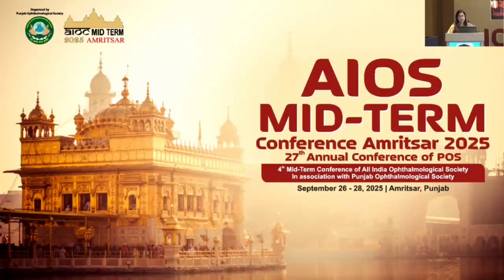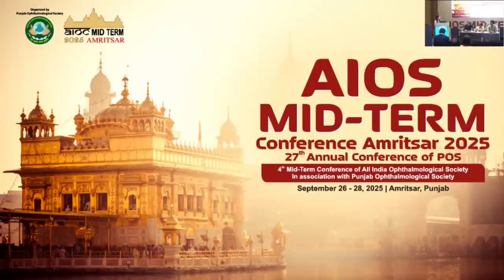I think you have summarized everything, the ERG and VEP as such. Tell me the few conditions in which you would like to do it, one or two. You are in a medical college? No, I'm in the Shroff Center, private. You tell me, hereditary retinal degeneration. So retinitis pigmentosa and also Stargardt's disease.